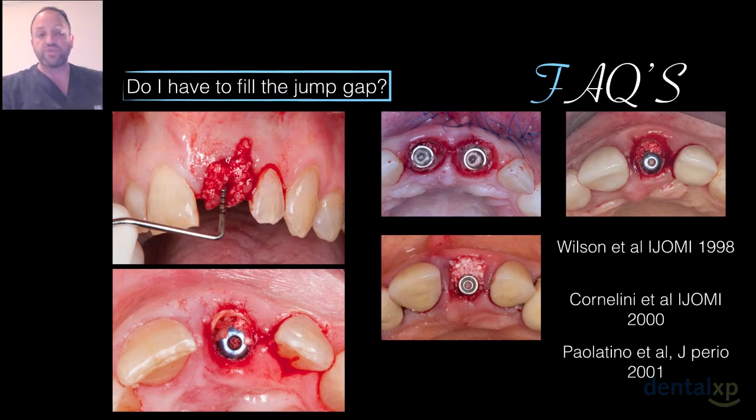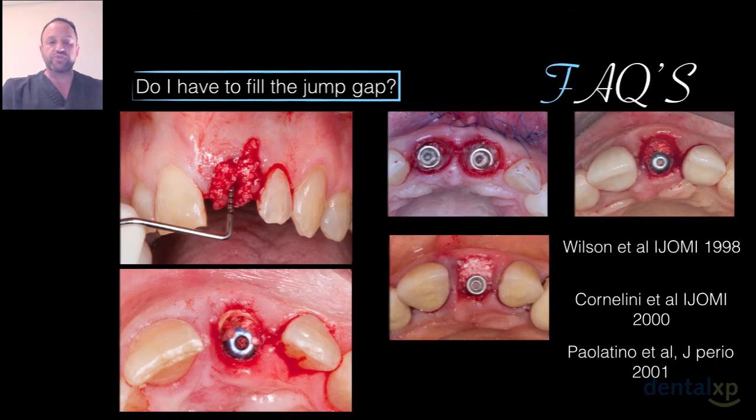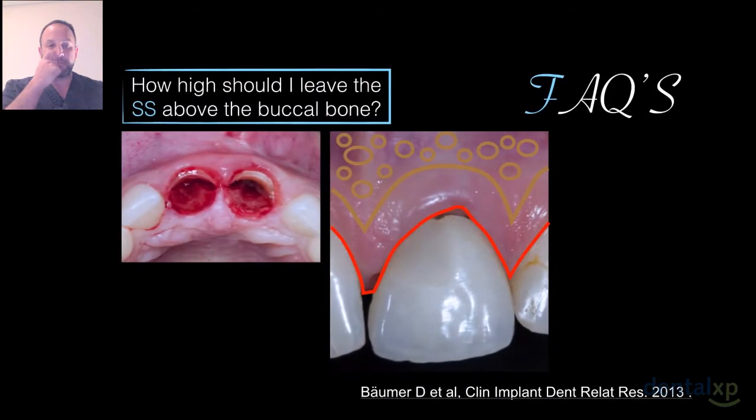I like to also use the dual zone therapy technique as described by Stephen Chu and Dennis Tarnow, to also support the soft tissue from collapsing at the top, and we'll talk about that a little bit later. But again, the jury's still out, and there's really no data for us. So I think you can use it, you don't have to use it, and you kind of need to work with it yourself and play with it and see what you feel is necessary there.